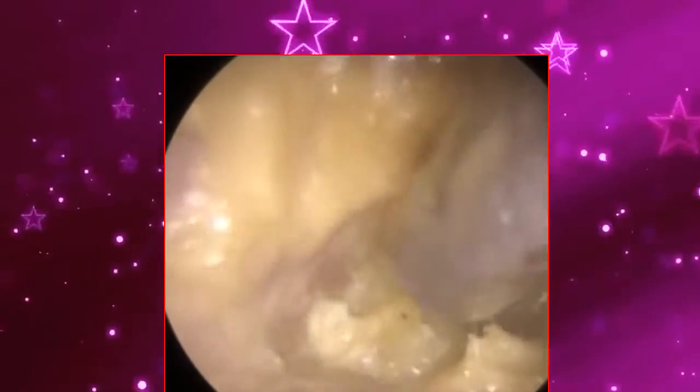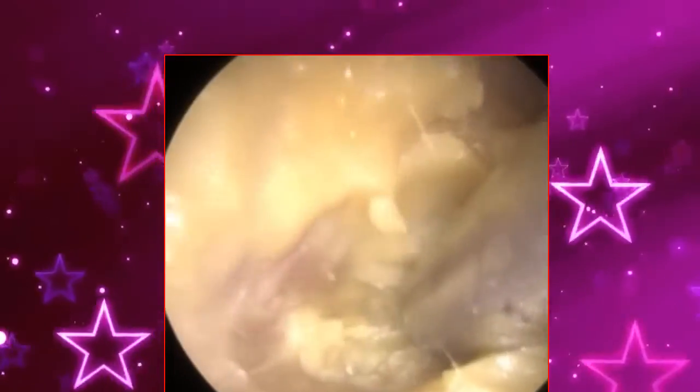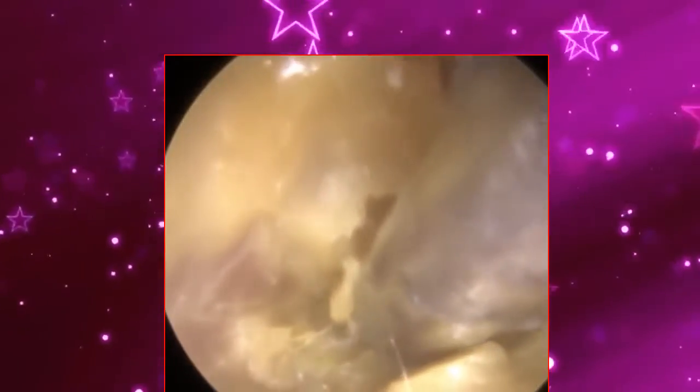So this particular patient has more superficial otitis externa. There wasn't much swelling, but the ear canal was slightly red, so it was a bit angry, with a lot of dry skin on the surface. The ear canal was completely blocked with debris, which I would say is dead skin that has accumulated in the ear canal itself, and it's become a bit soft and mushy. It's one of the harder types of debris to remove because of the consistency. It's quite mushy, so I've put some drops in there, some olive oil, just to change the consistency.